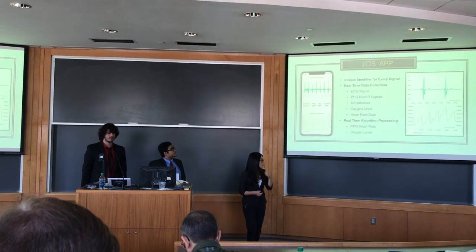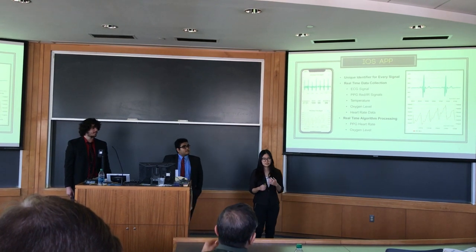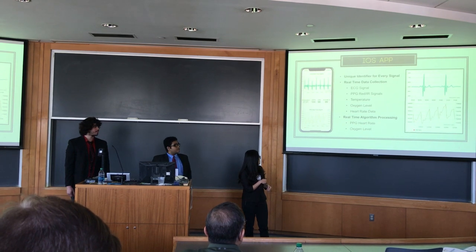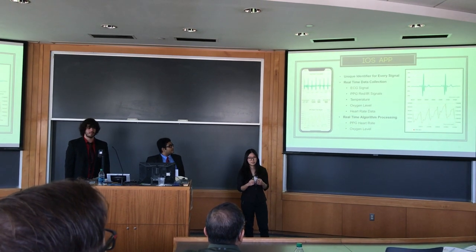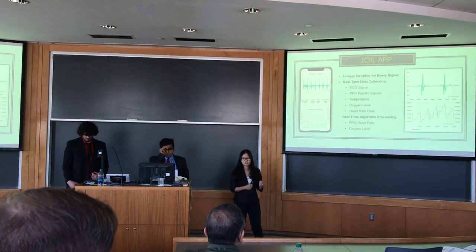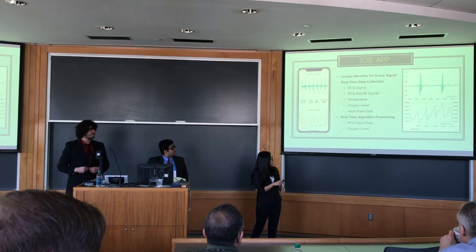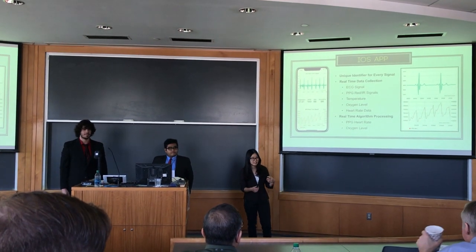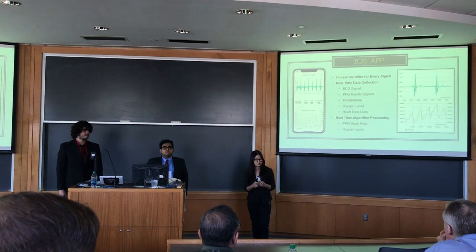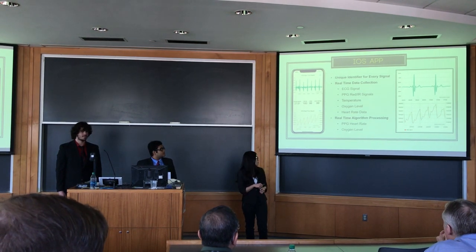To communicate with our wearable device, we developed an iOS app. All the vital signals will be collected by the mobile phone. As we can see here, the ECG and PPG data are shown in two plots. All the other vital signals, including temperature, heart rate, and oxygen level, are displayed in the middle. Here we can take a closer look at the data that we collected and saved by the mobile phone. To save more memory and power for the microcontroller, some of the algorithms are processed in our mobile phone.